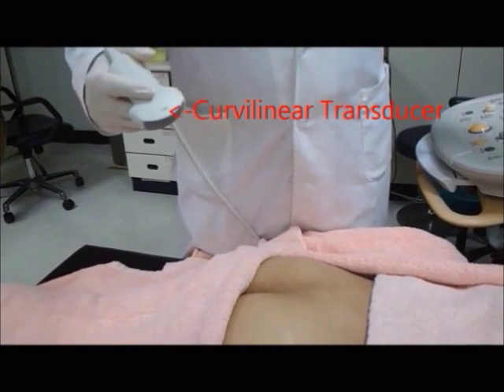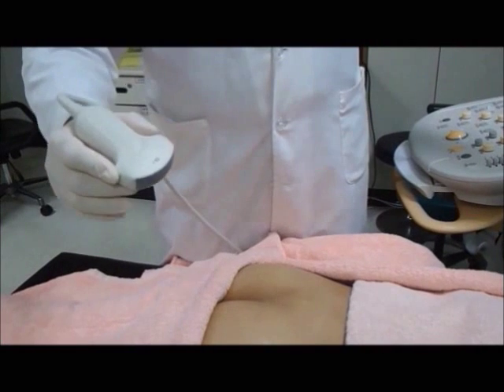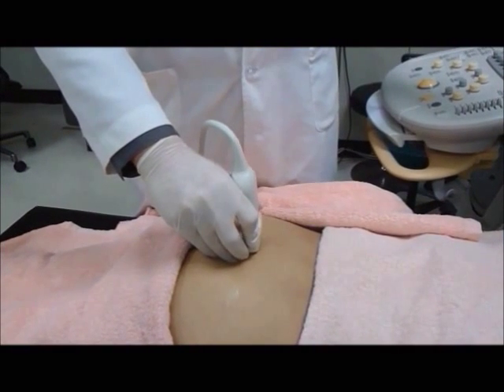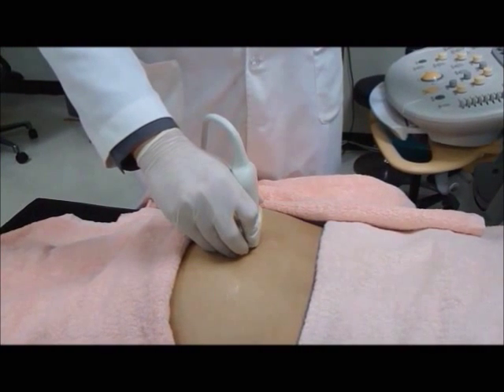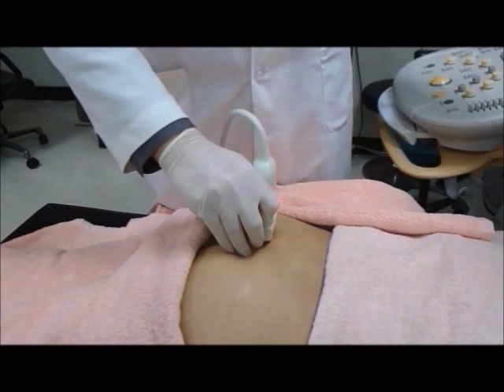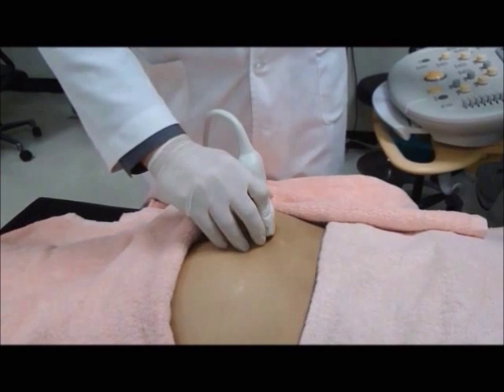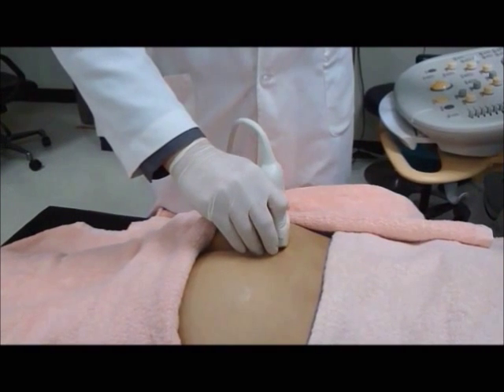Similar to the caudal epidural injection, the probe is positioned in a transverse orientation to identify the sacral hiatus first. After identifying the sacral hiatus, the probe is then moved in a lateral position until the lateral edge of the sacrum is observed. Then the probe is moved in an upward or cephalad direction until you see the sacroiliac joint.